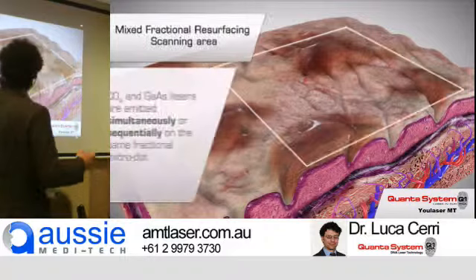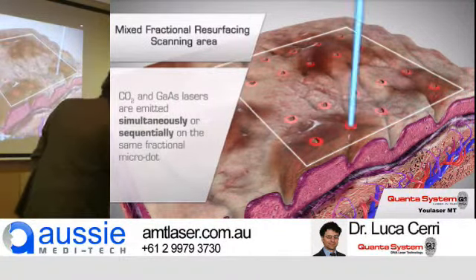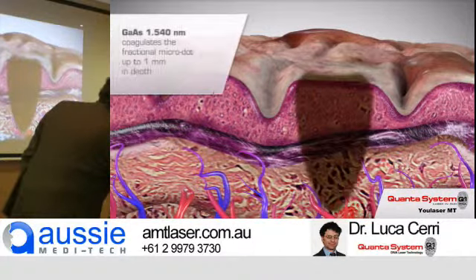This is an example of a treatment of acne scars. This is an example of a keloid, where we are doing both things in the same moment.